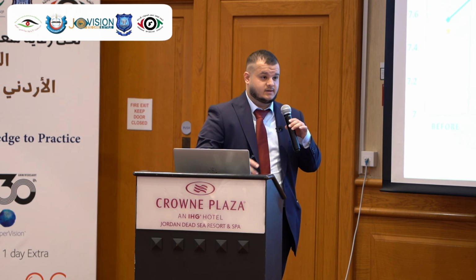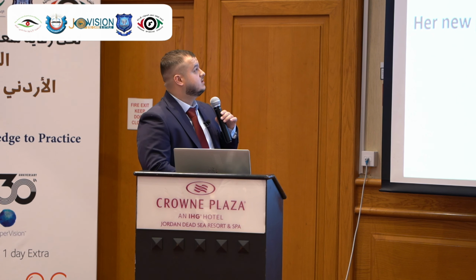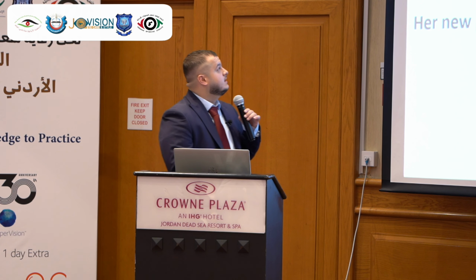In this case, we reached our purpose to control myopia by using Ortho-K, and the Ortho-K lens worked very well with this case. Now we start with case number 2. Female, 11 years old. She is myopic, wearing glasses. OU was -2 diopter. We did observation, which revealed a rise of about 1.5 along 1 year. We advised parents and patient to use Ortho-K lens, explaining its role in controlling myopia progression.